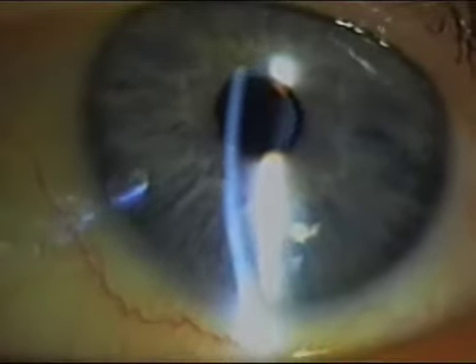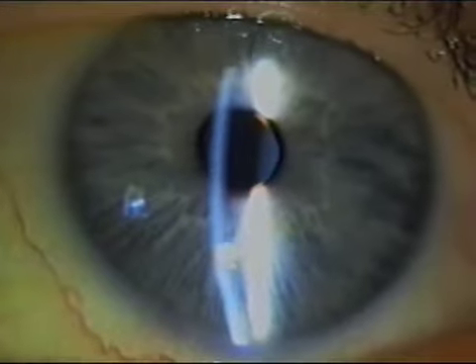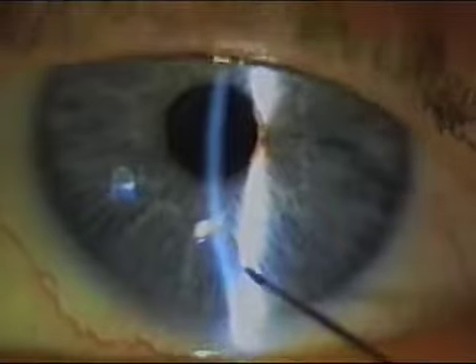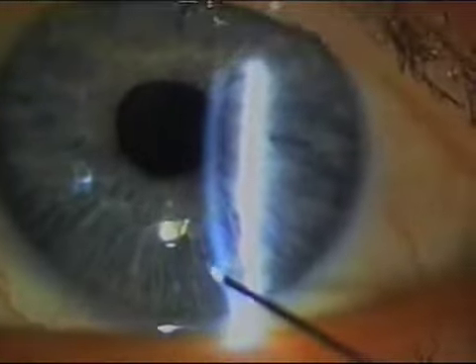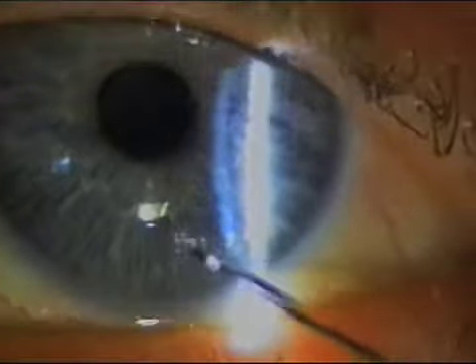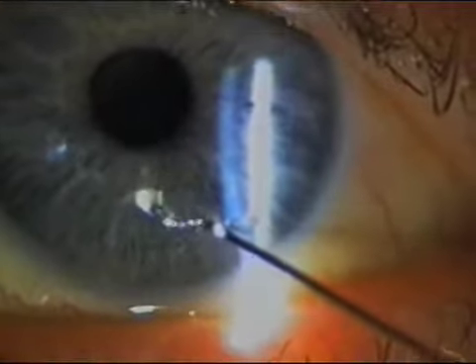This is yet another patient that I'm going to lift at the slit lamp. Here you can see this patient has epithelial ingrowth, and this is one of the reasons that it's nice to be able to identify the exact edge, to help reduce the chances of epithelial ingrowth. And again, one drop of anesthetic, 30-gauge needle just used to slice the epithelium, hold on to the upper lid, and then go underneath the flap edge to just make sure that you can lift it just enough that in the operating room it'll be easy to identify where that flap edge is. And that's really all you need to do.